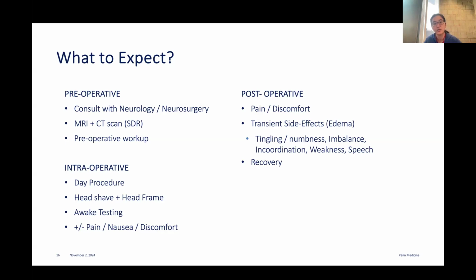So if we find that, we would usually give you a ring or arrange a consultation either over telemedicine or in person to discuss with you again. So we usually tell patients that this is our calculation. We know or we expect that we have to give more energy, which means we expect patients to have more discomfort. Now, some patients would tell us that I still want to go ahead, I want to try, I have high pain threshold, we would go ahead and try.